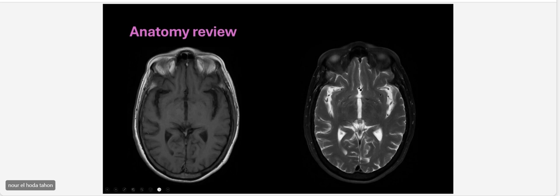So most of the time, this looks like a perivascular space, what we call a prominent perivascular space, unless you see something, like some FLAIR changes around it, and it's very hard to decide from T1 and T2. For sure, I can say this is an infarct or something, but if you see this in a young age, you can simply say it is a prominent perivascular space.